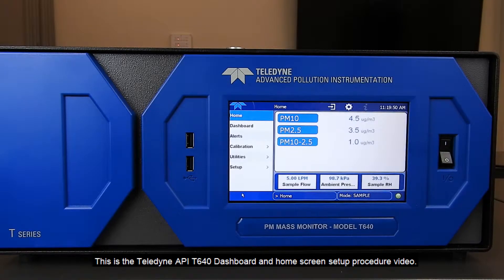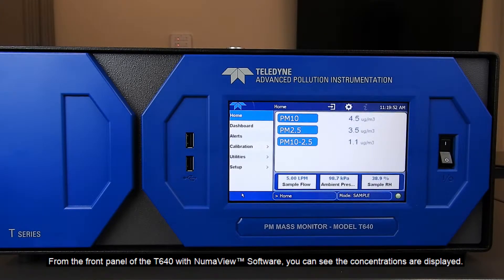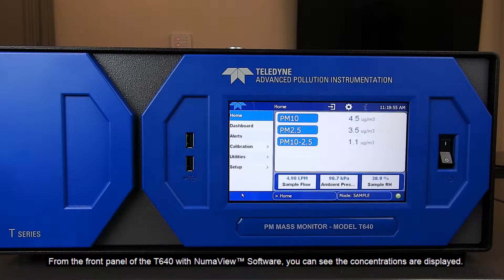This is the Teledyne API T640 dashboard and home screen setup procedure video. Here we have the front panel of the T640 with Numaview software. From the front panel you can see the concentrations are now displayed.